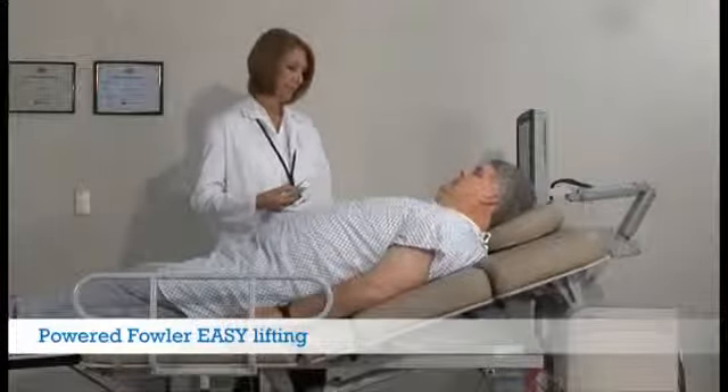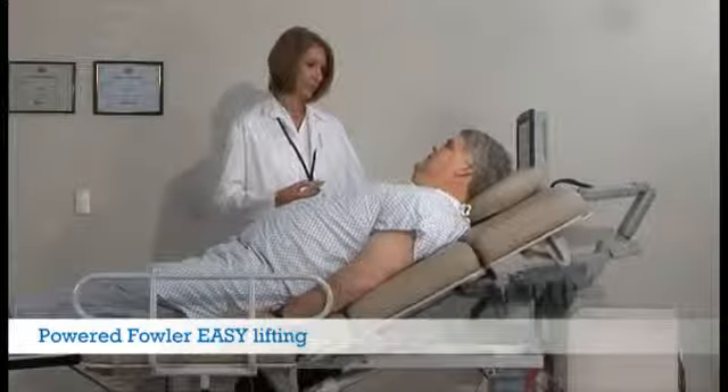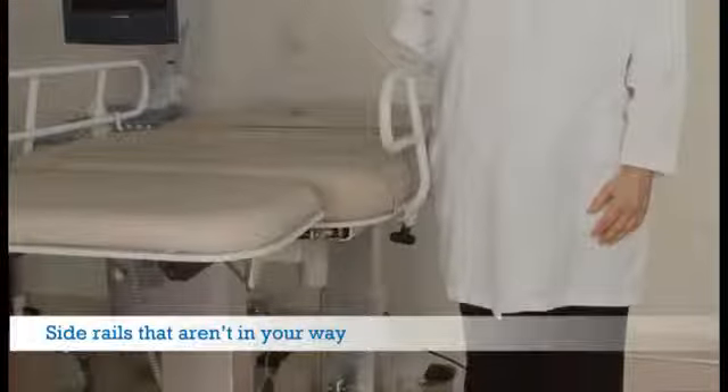Helping large patients sit up is a safety concern for all sonographers. To address this positioning need, Oakworks ultrasound tables feature a powered fowler. Our side rails are designed with ergonomics in mind — they lock securely in place and allow sonographers to get very close to their patients with no sharp surfaces.